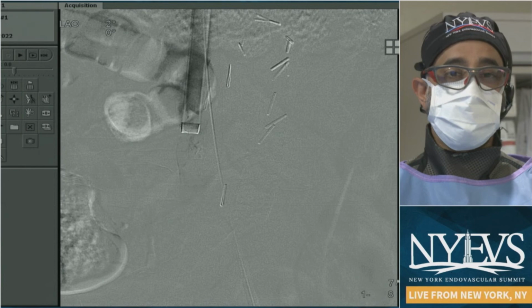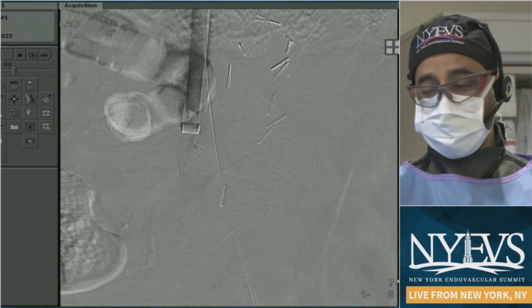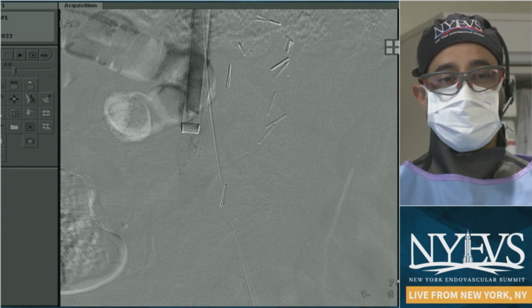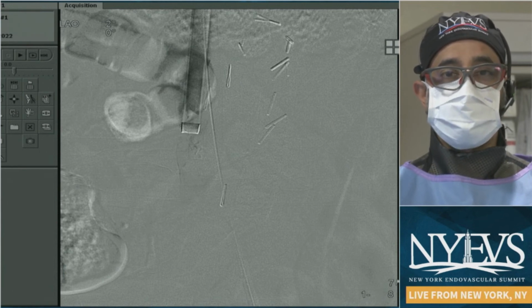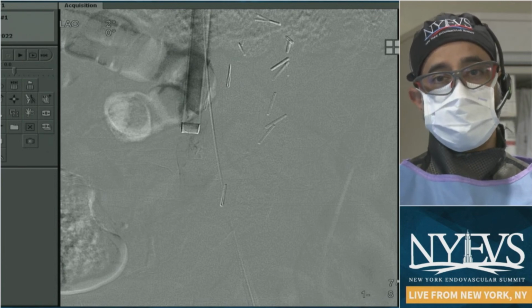And the thing is, it's severely tilted, it's penetrated. These things will probably get worse. With this, specifically this filter, I'm a little worried about it breaking at some point as well. So it's also sort of filter dependent, but we do have this long discussion with them about the risks and benefits of removing it.